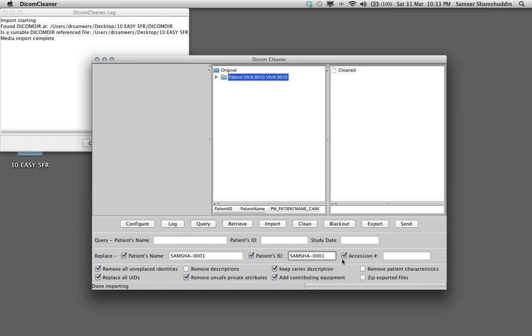Tick the accession box but don't type in anything. Click all, remove all unreplaced identities, remove descriptions. Keep series description. Keep this one checked so that if you are doing an MR examination you know which one is T1, T2, etc. and different sequences.